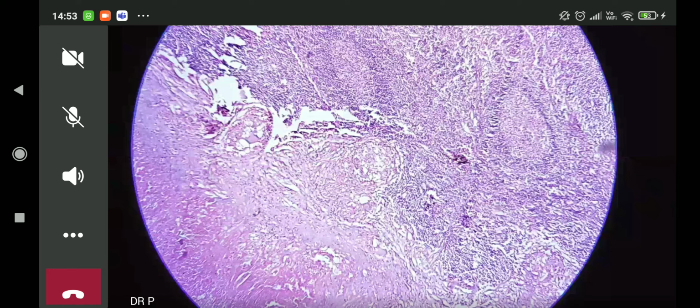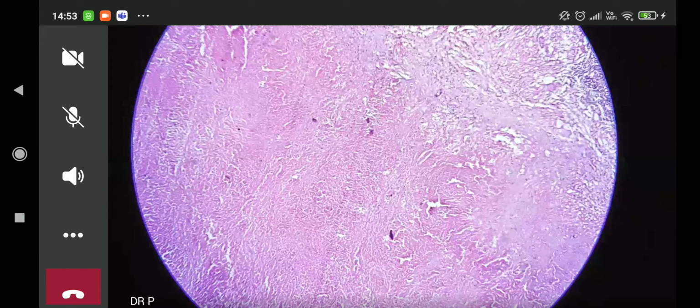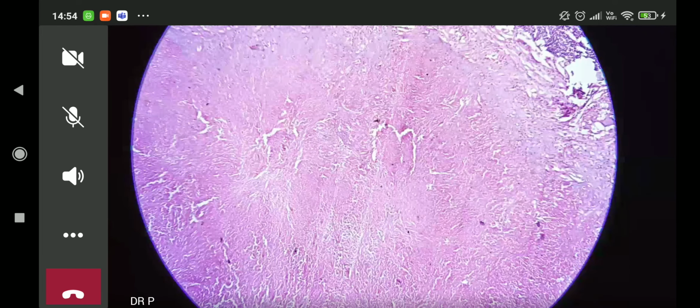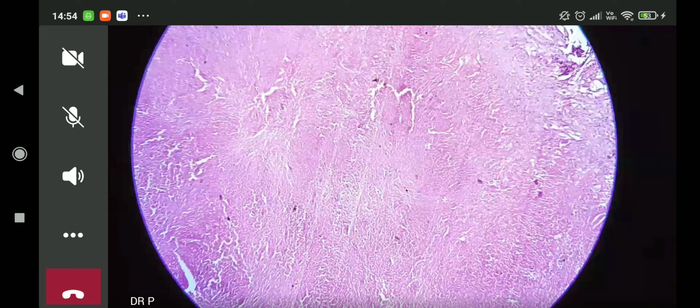There is one important point, children, I want to make to you, and that is about caseous necrosis. Again, that's an interesting point. Caseous necrosis in a lymph node may not be present in cases of TB. Sometimes you have to hunt for the caseous necrosis. So in this particular case, you can see that it's completely replaced by caseous necrosis. In gastrointestinal TB, for example, or in adrenal TB, you sometimes even have to hunt for the caseous necrosis. So it's not an easy diagnosis.